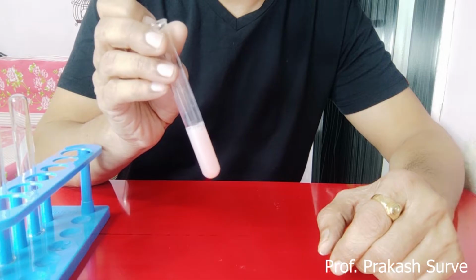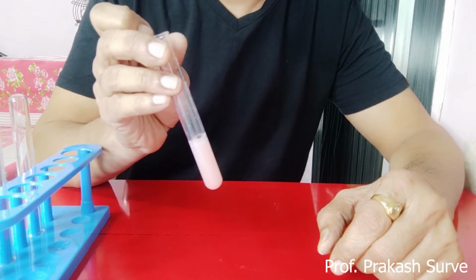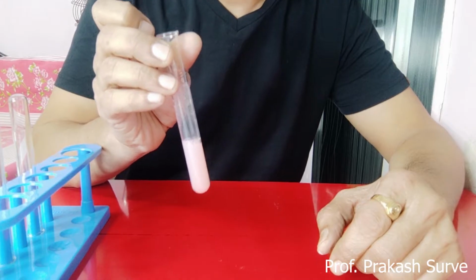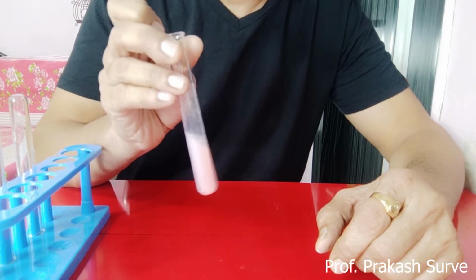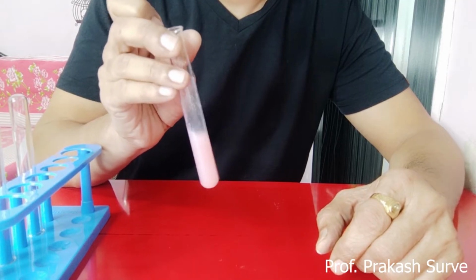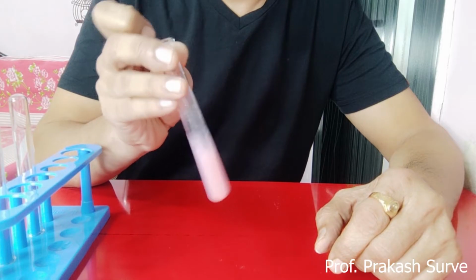We'll repeat the procedure here. We'll take the test tube. In that we'll take approximately 2 ml of the urine sample, then a pinch of the soybean flour, then we'll shake it, and after that we'll add a few drops of the phenolphthalein indicator, and then we'll keep it for a few minutes.